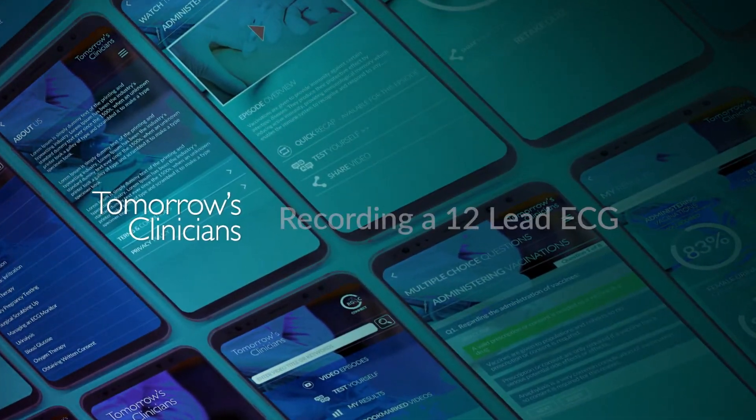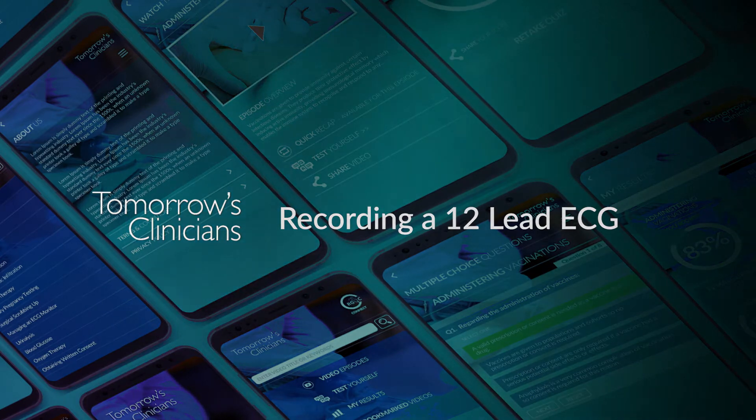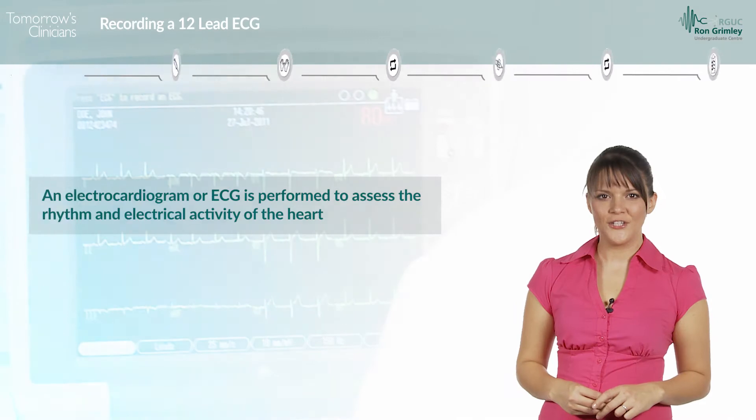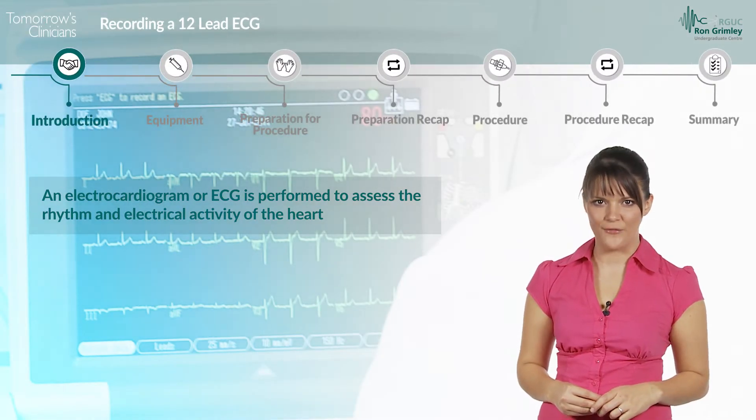In this episode of Tomorrow's Clinicians, we will be looking at the procedure of recording a 12-lead ECG. An electrocardiogram, or ECG, is performed to assess the rhythm and electrical activity of the heart.